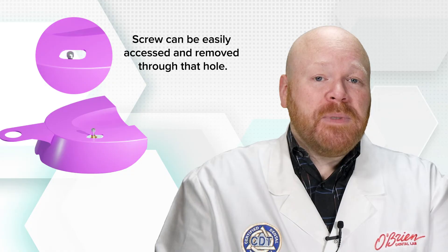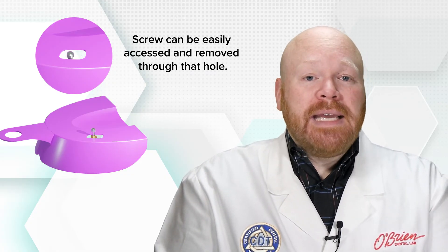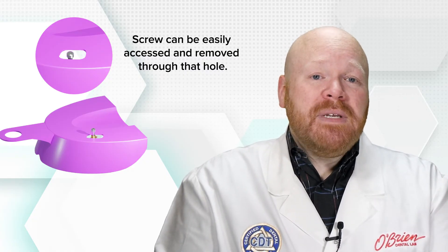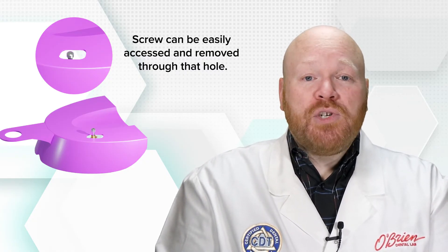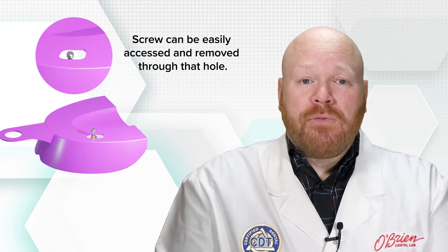After you've created the hole, place the tray back in the mouth to make sure the hole was created in the correct location. Depending on the length of the impression coping, it may not actually stick through the tray. The important thing is that the screw can be easily accessed and removed through that hole. If needed, make some additional adjustments to the tray to ensure the impression coping or the impression coping screw will fit passively through the hole.